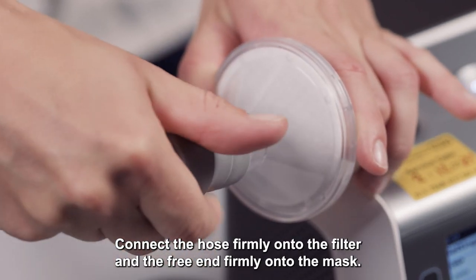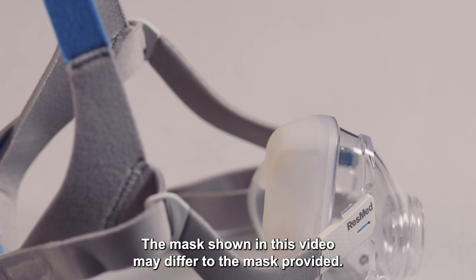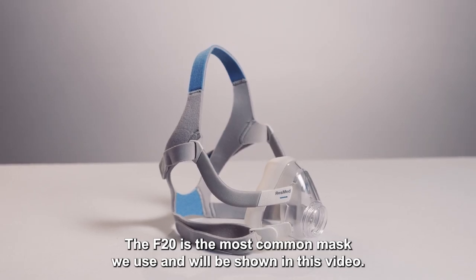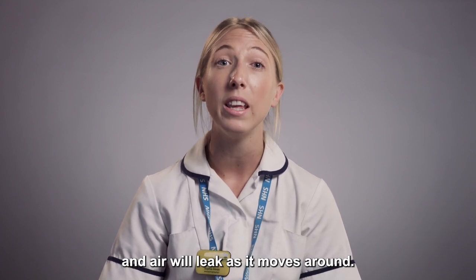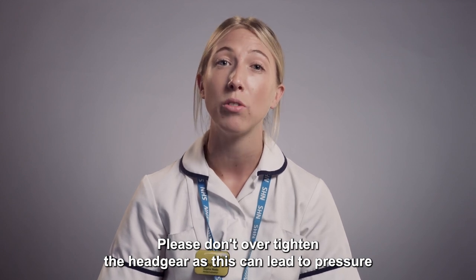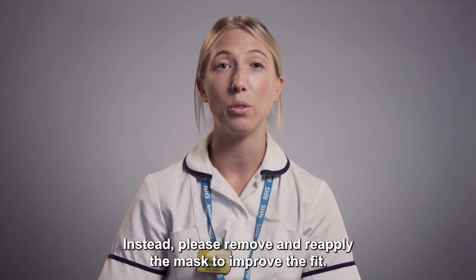Connect the hose firmly onto the filter and the free end firmly onto the mask. The mask shown in this video may differ to the mask provided. The F20 is the most common mask we use and will be shown in this video. The mask has a cushion which allows a firm seal to be made. If the mask is dirty, it will not form an effective seal and air will leak. Please don't over tighten the headgear as this can lead to pressure areas, particularly on the bridge of the nose. Instead, remove and reapply the mask to improve the fit.